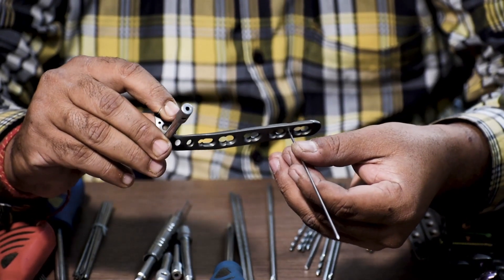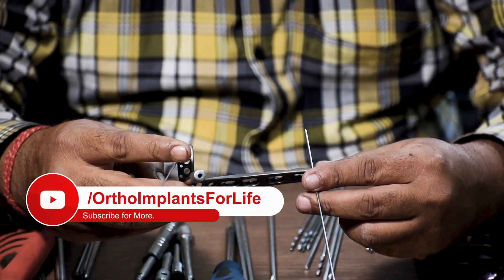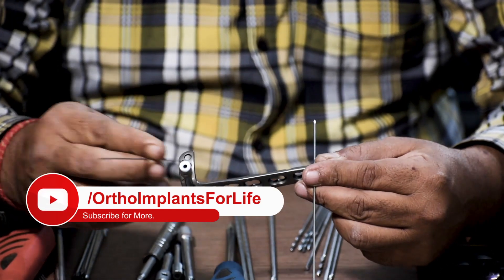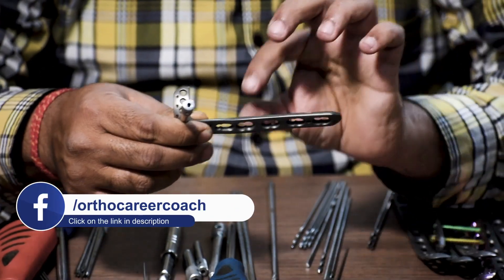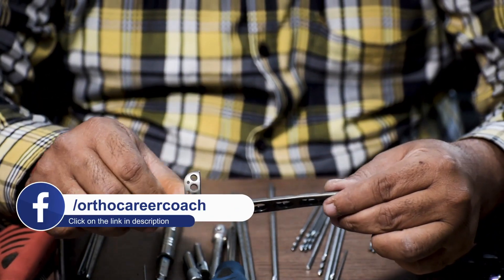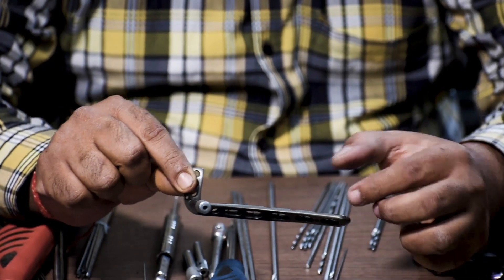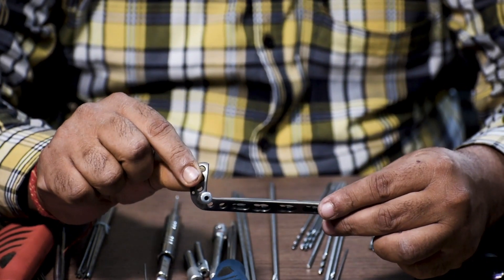Two K-wires are used to keep the plate stable — one in the distal part and one in the shaft region. Hereafter we can proceed to the fixation of the screws. This is the shaft region of the plate and this is the distal head of the plate, also known as the cancellous part. So we use a cancellous screw in the cancellous part and a cortical screw in the shaft region.